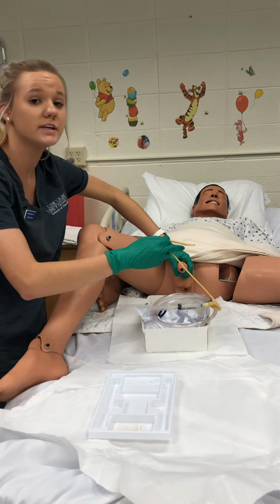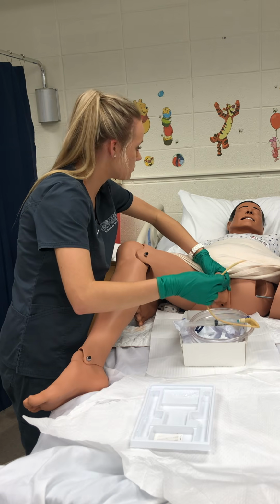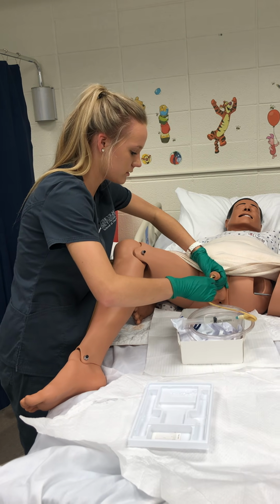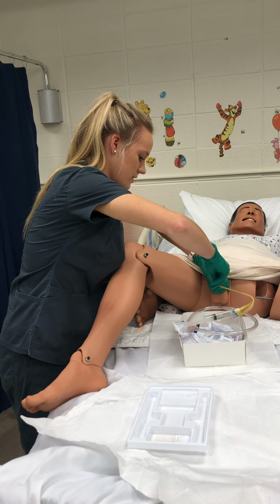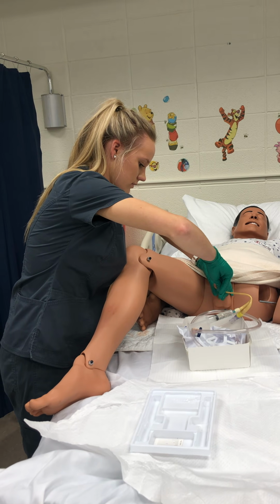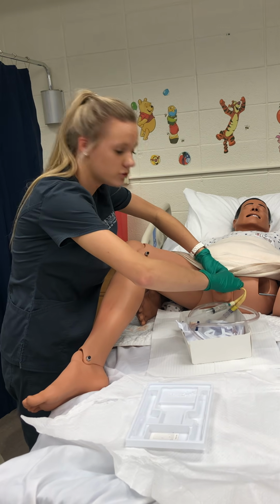I'm going to tell my patient to take some deep breaths and bear down like he's going to void. Mr. Jones, you're going to feel some pressure. I'm going to go ahead and insert it. I'm going to go 7 to 9 inches for a male with that lubrication of 6 inches. When I see urine, I'll go another 2 inches.